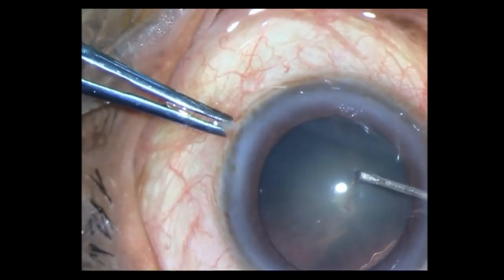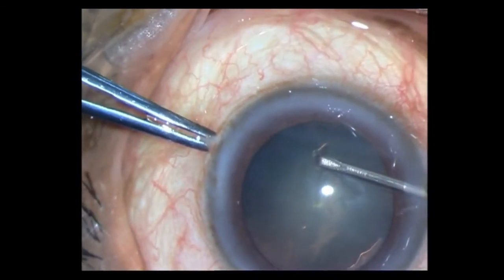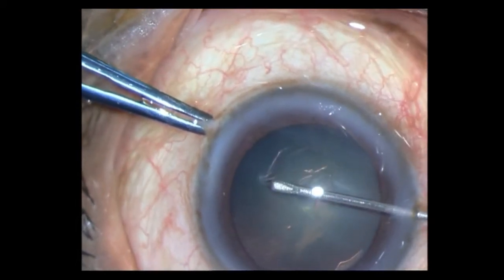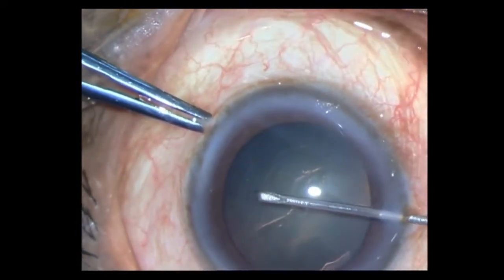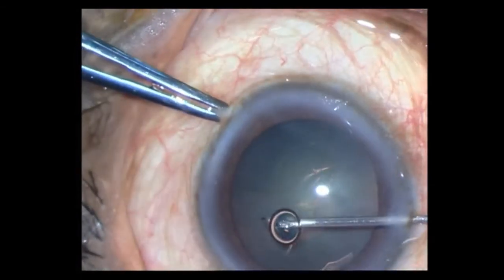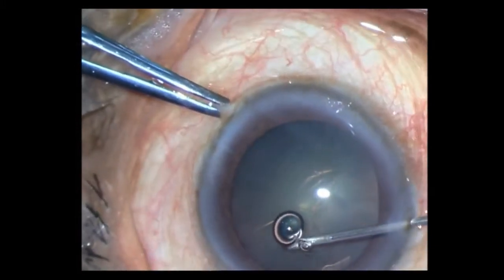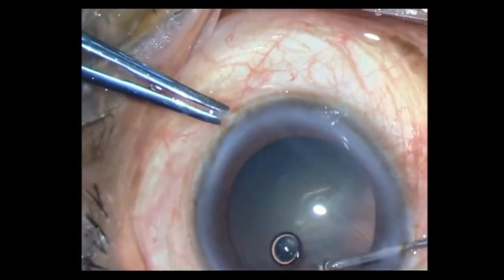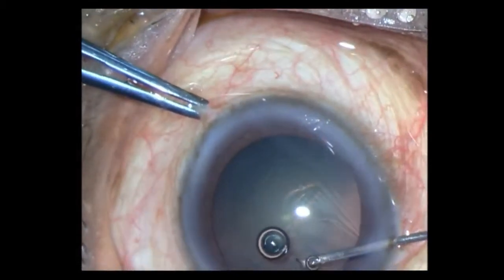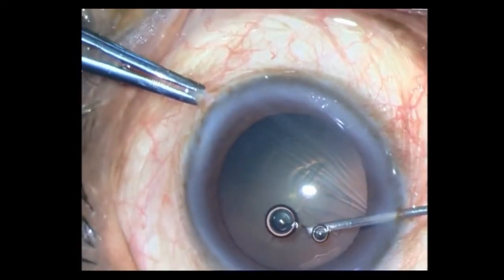Initiating the rhexis and then lifting up a flap, slowly guiding it around to make a 5.5mm rhexis. Since this cataract was very soft, it's not a very good idea to chop it because you're not going to get a very good hold on it, and hence I have decided to do a divide and conquer, mainly for demonstration.